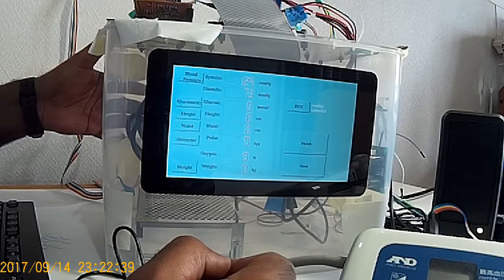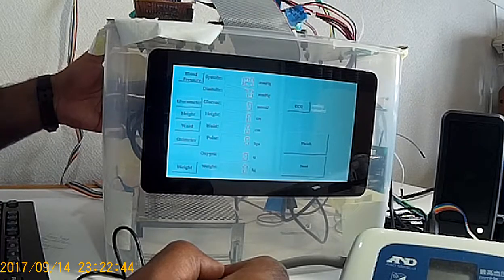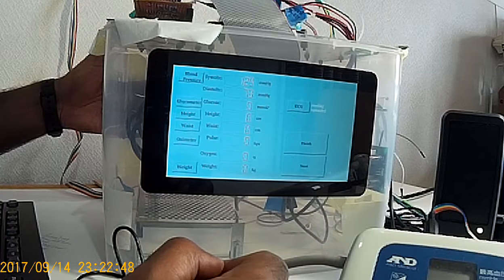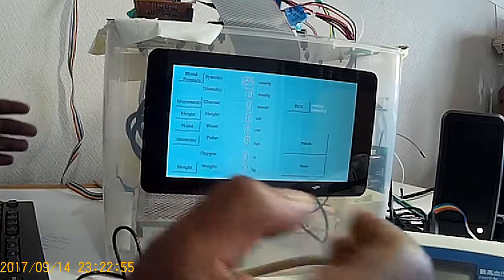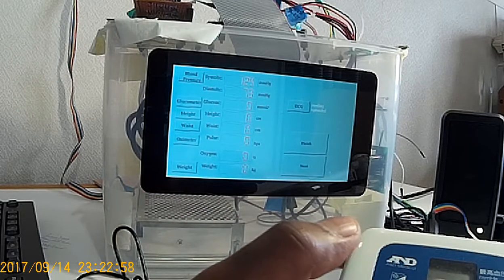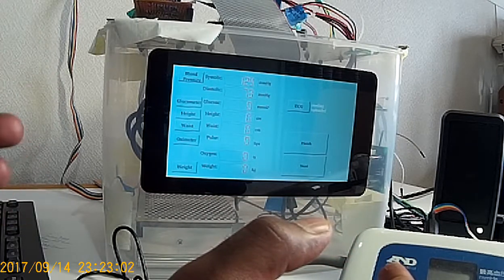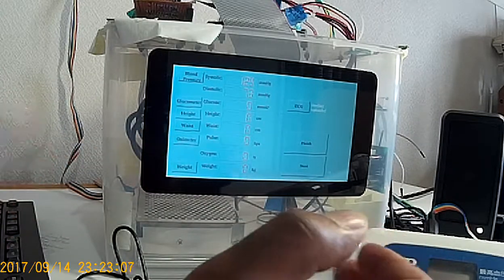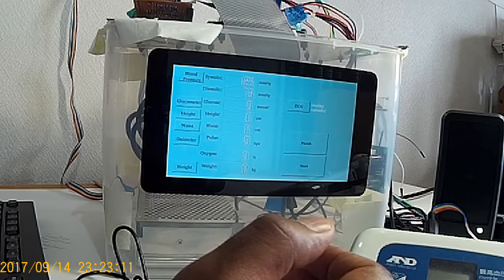The EHealth kiosk is connected to the internet, which is a very good opportunity to connect to a server on the internet where we have a database of all the users kept securely, and that record is going to last for a very long time, over many years, and we can see our change in physiology over a long stretch of time. That's very helpful in terms of noticing the changes our body is going through.